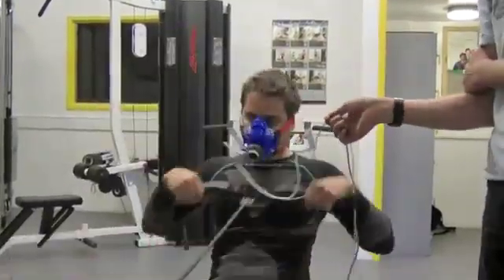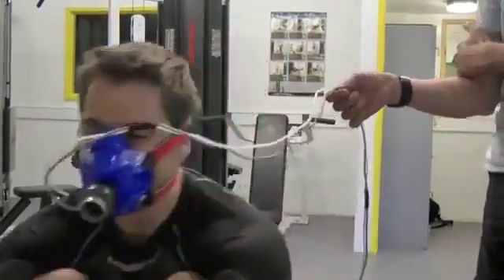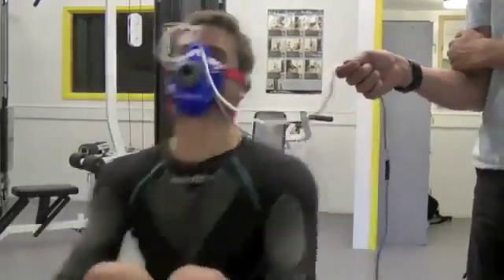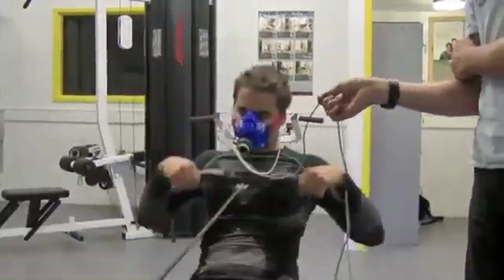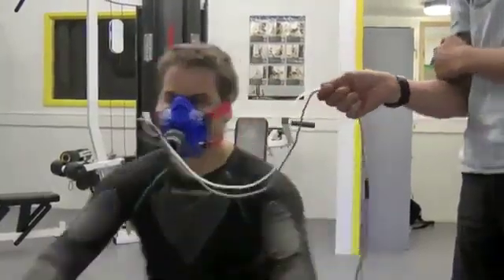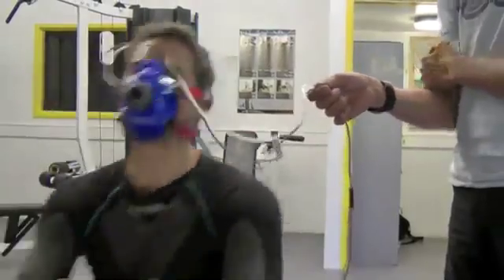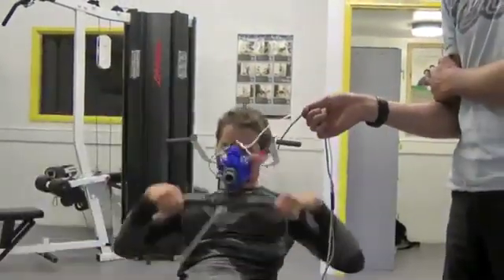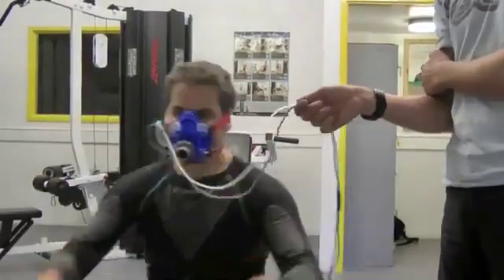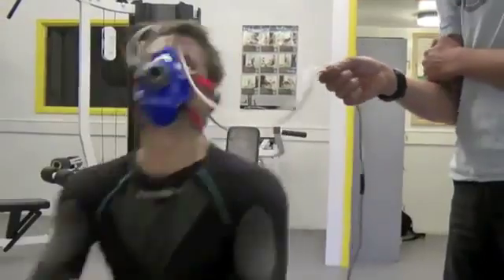Okay, that's 45 seconds to go. Looks good, Marion. Keep it going. Come on, push it out. 30 seconds. Really hard — this is maximal. Come on now, you should be sweating. Really hard, keep it going. Come on, Marion, push it hard. Push it harder. Not long to go. Keep going, keep going. Really hard.